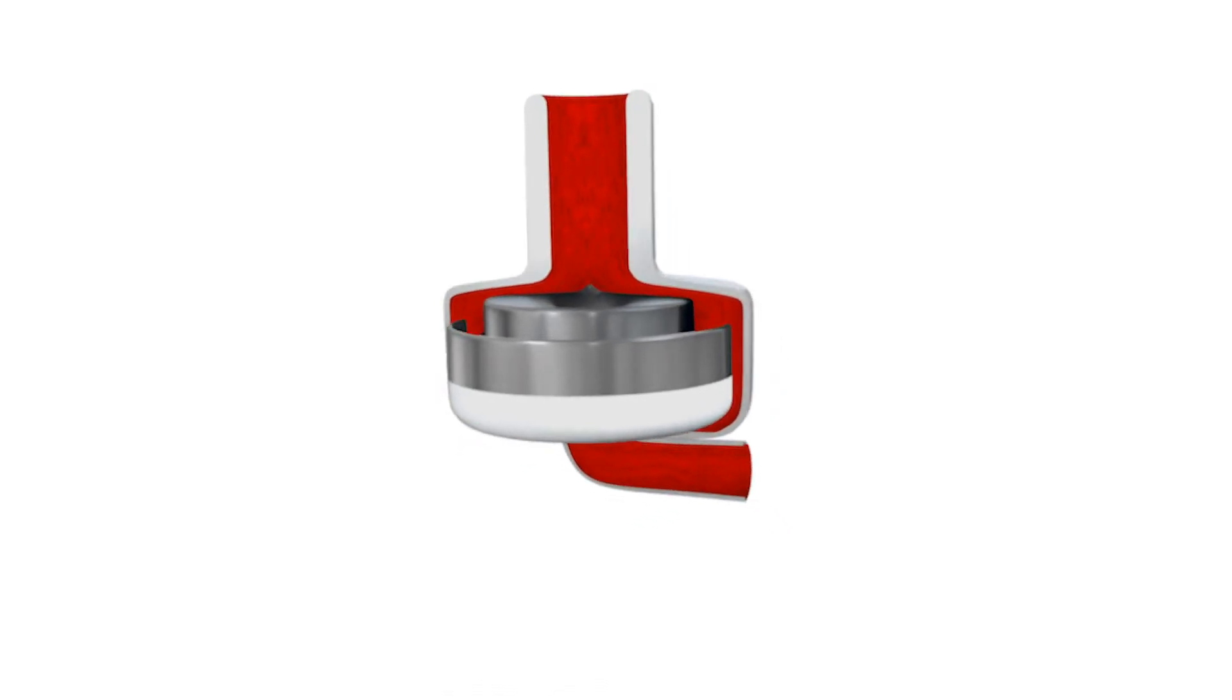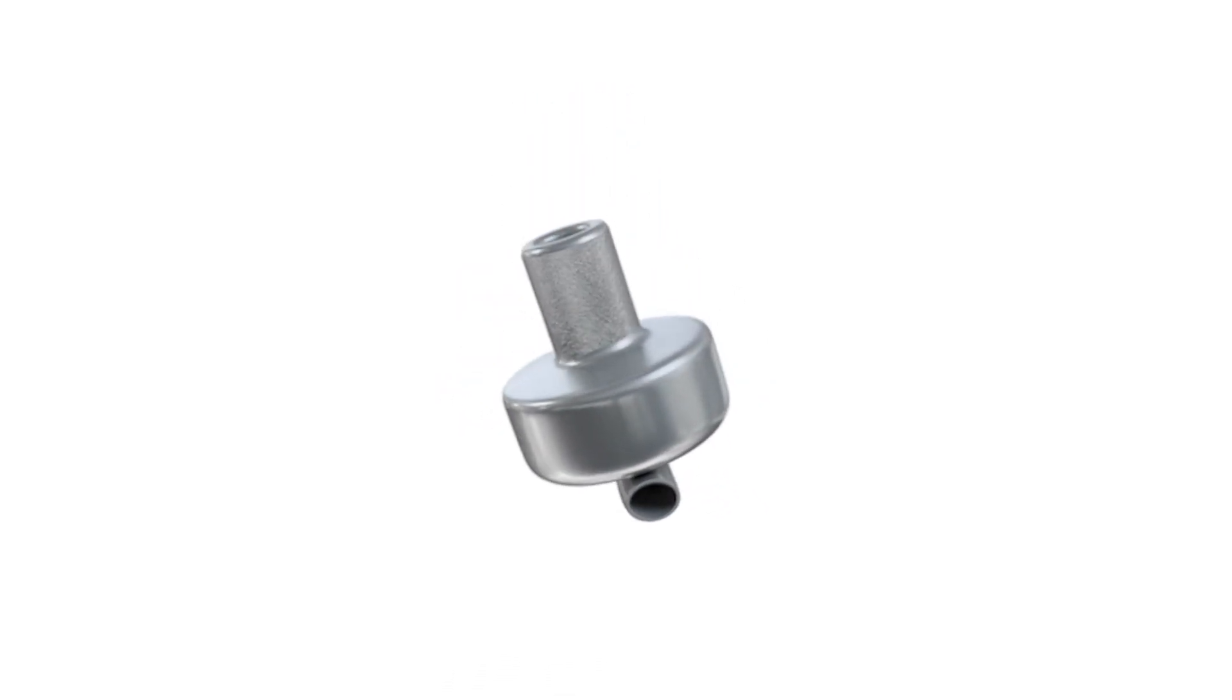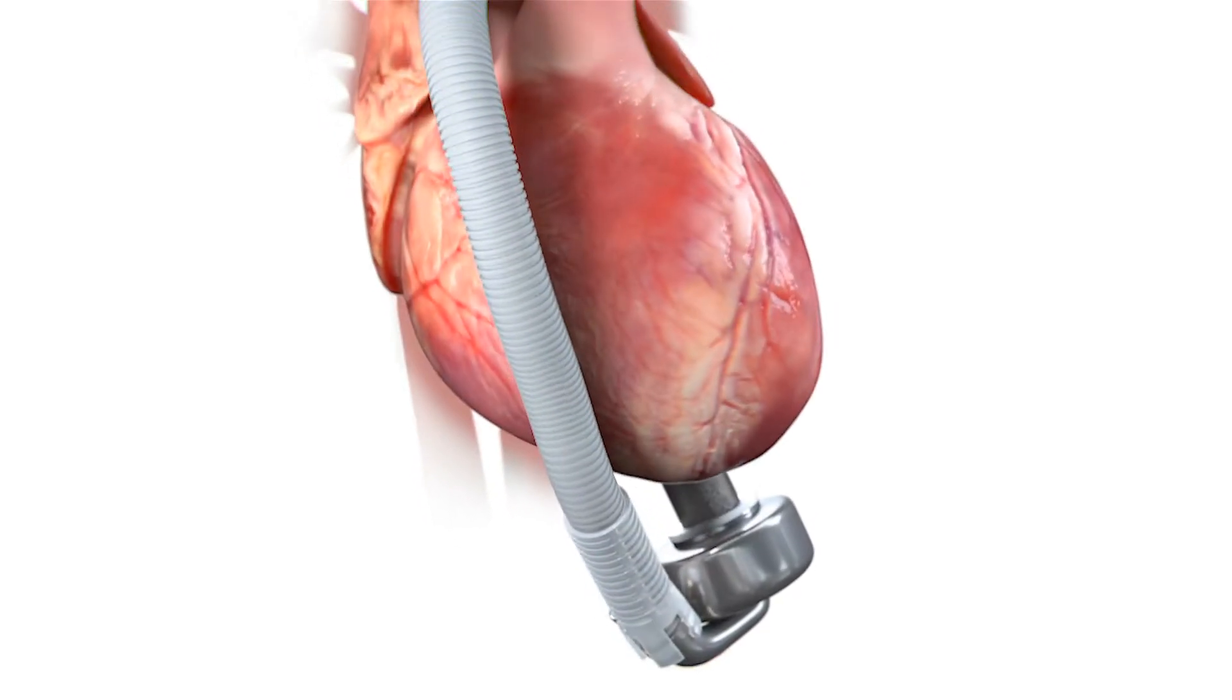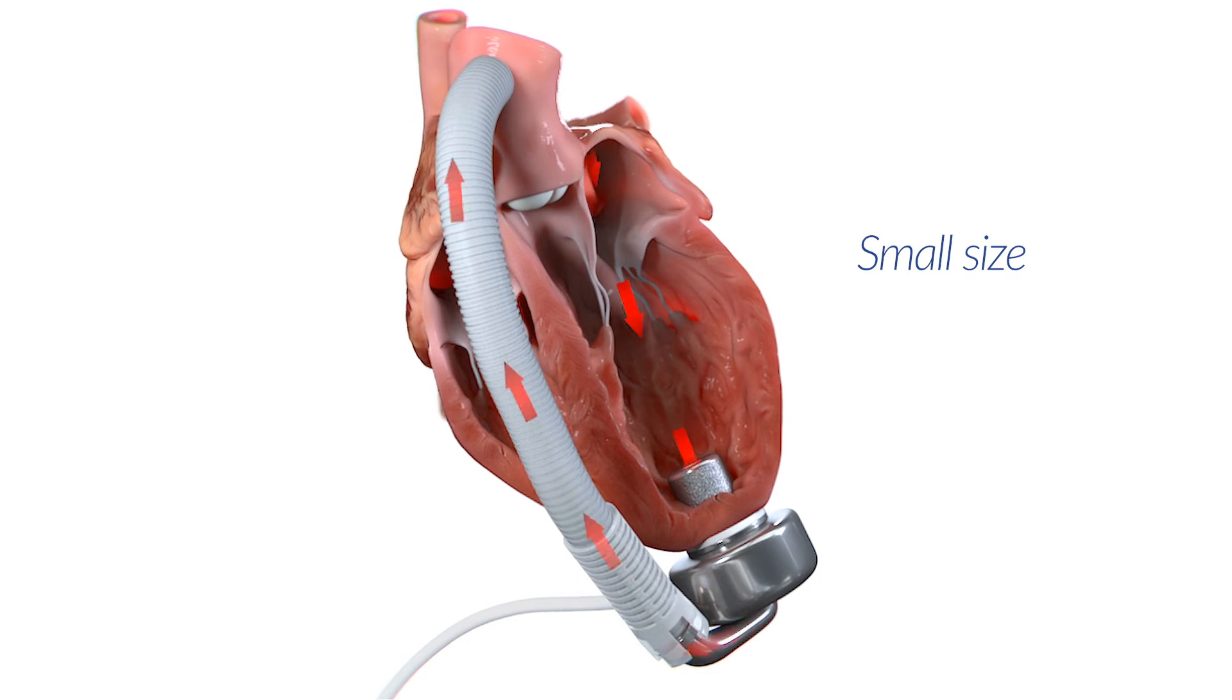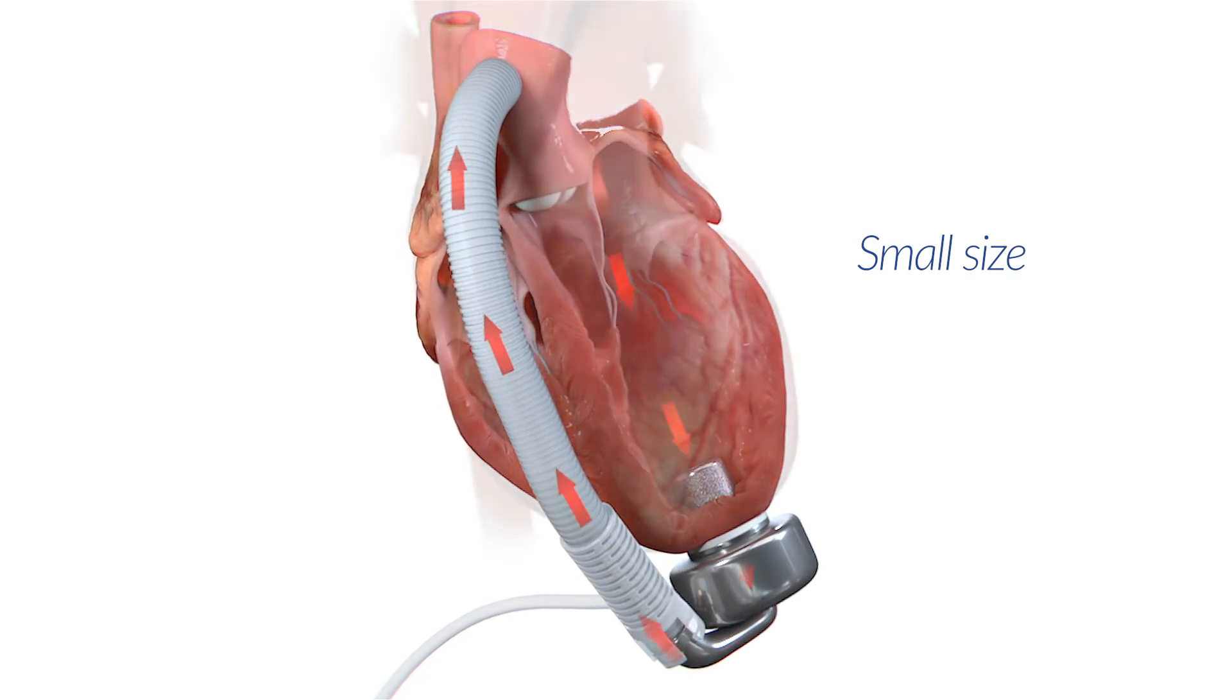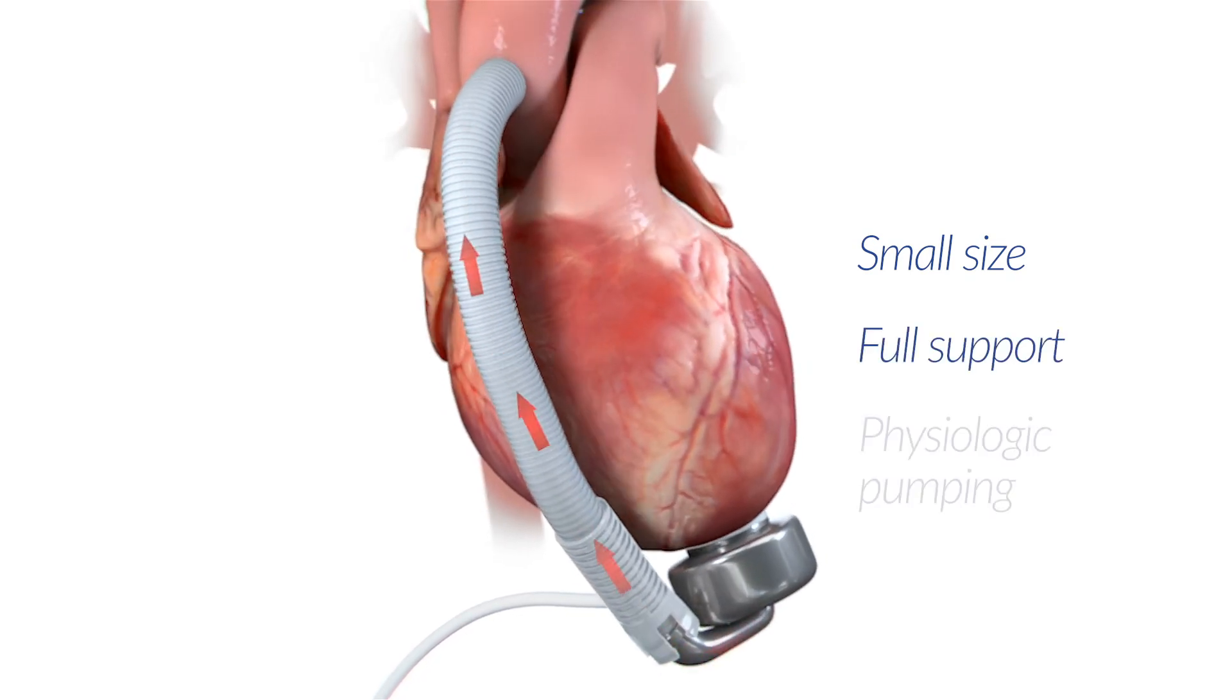CoreWave is implanted at the apex of the left ventricle and ejects blood into the ascending aorta. Its small size is compatible with less invasive surgery procedures while providing full support and physiologic pumping.